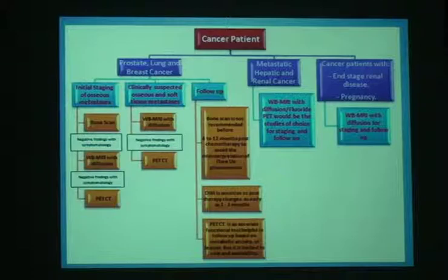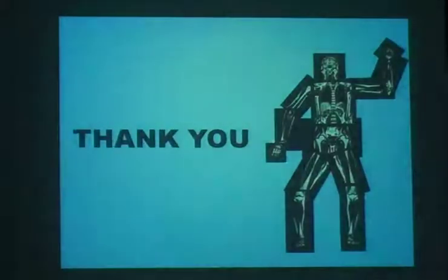Also those with chronic renal disease, end-stage renal disease, pregnancy, and preferably in the pediatric age group, then a whole body MRI with diffusion for staging and follow-up would be advised.